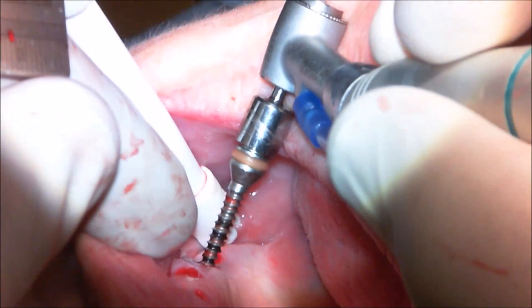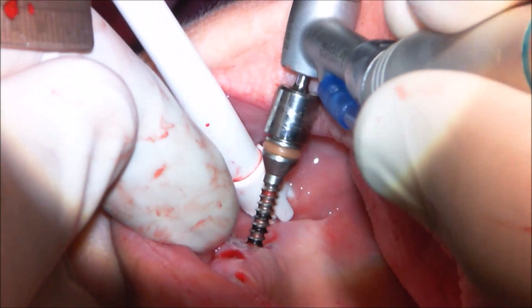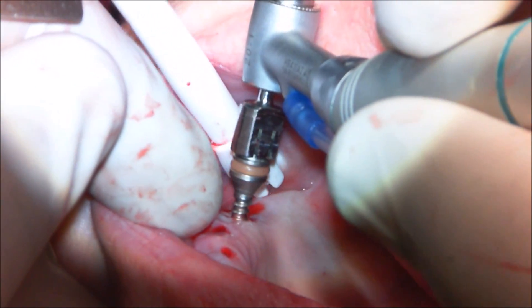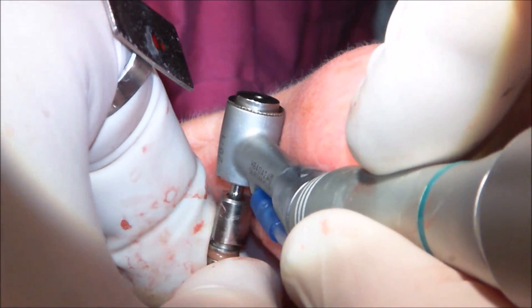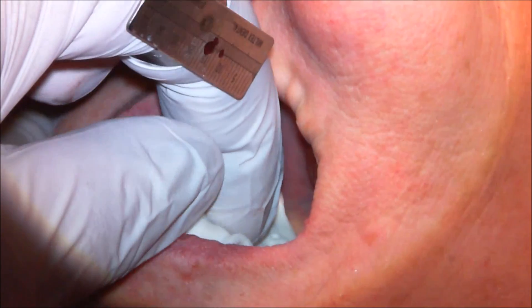Now the final side is expanded. All of the implant sites are now at their final diameter and ready to accept the implants.